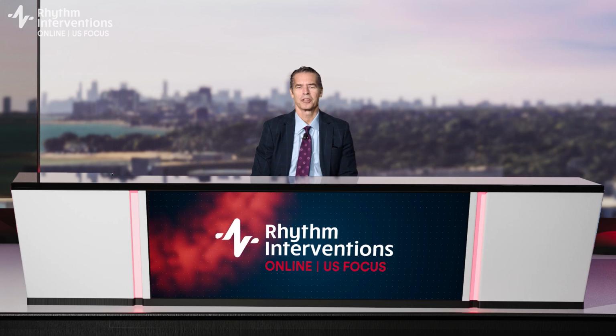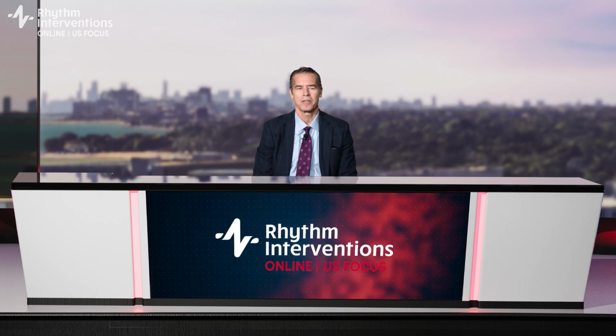Welcome to session 4 of RIO 2024, a United States Focus. In this session, the topic will be enhancing safety and efficacy in atrial fibrillation. And in keeping with our theme of pulse field ablation, we'll hear about a case of variable loop guided PVI.